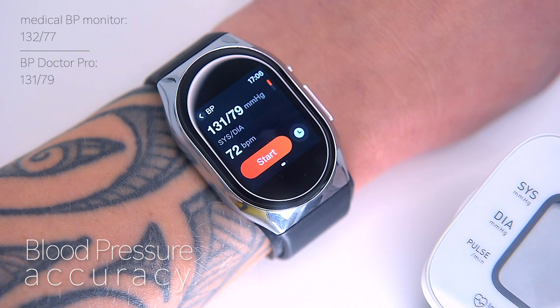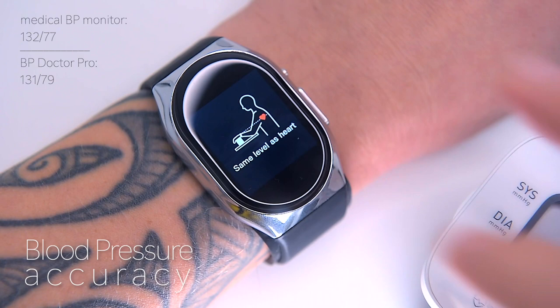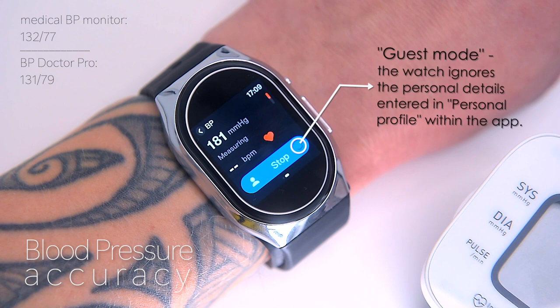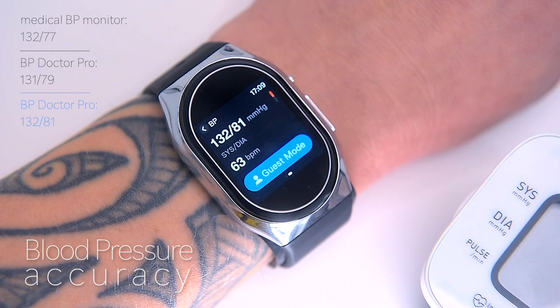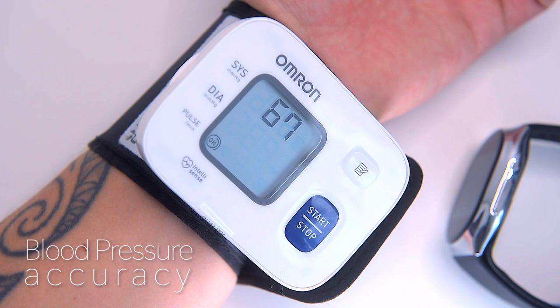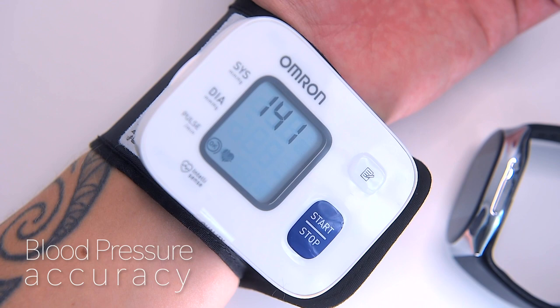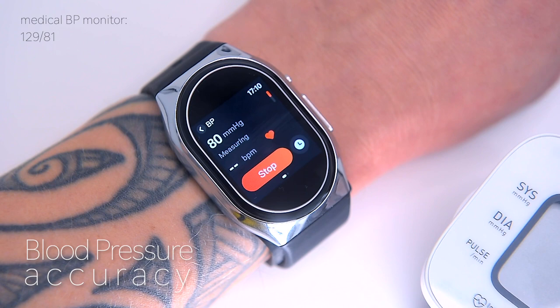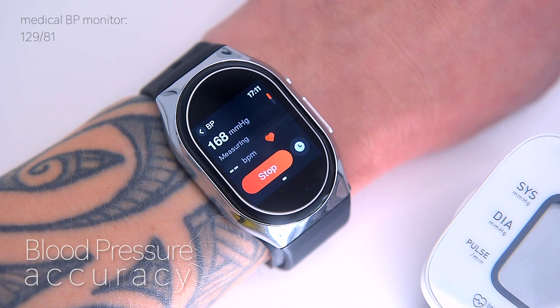Let's repeat the test. The BP Doctor Pro can also measure blood pressure in guest mode, which means it doesn't use the personal details entered in the profile such as age or weight. The reading is 132 by 81 mmHg — that's in line with the medical device. Repeating once more: normal blood pressure for adults is less than 120 by 80 mmHg according to the American Heart Association. The reading is 129 by 80 mmHg. With BP Doctor Pro the reading comes in at 129 systolic and 80 diastolic — again in line with the medical device.